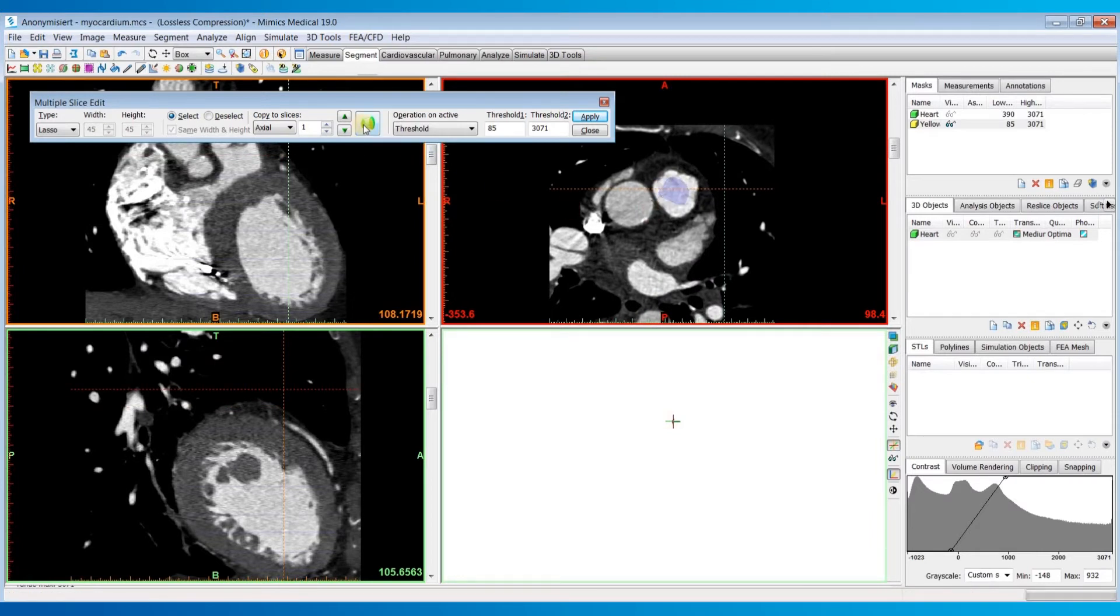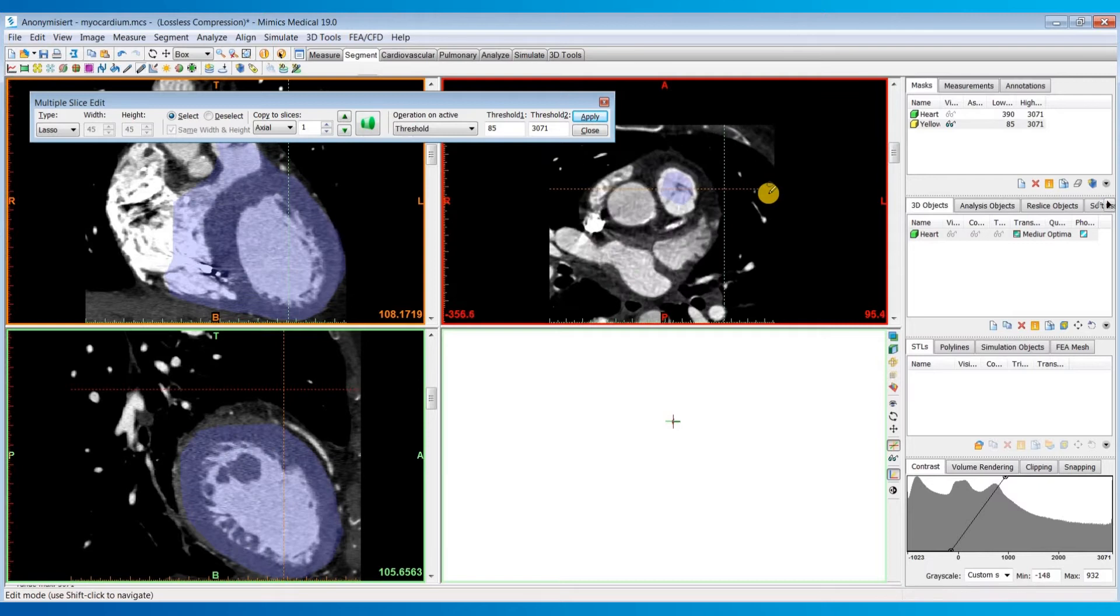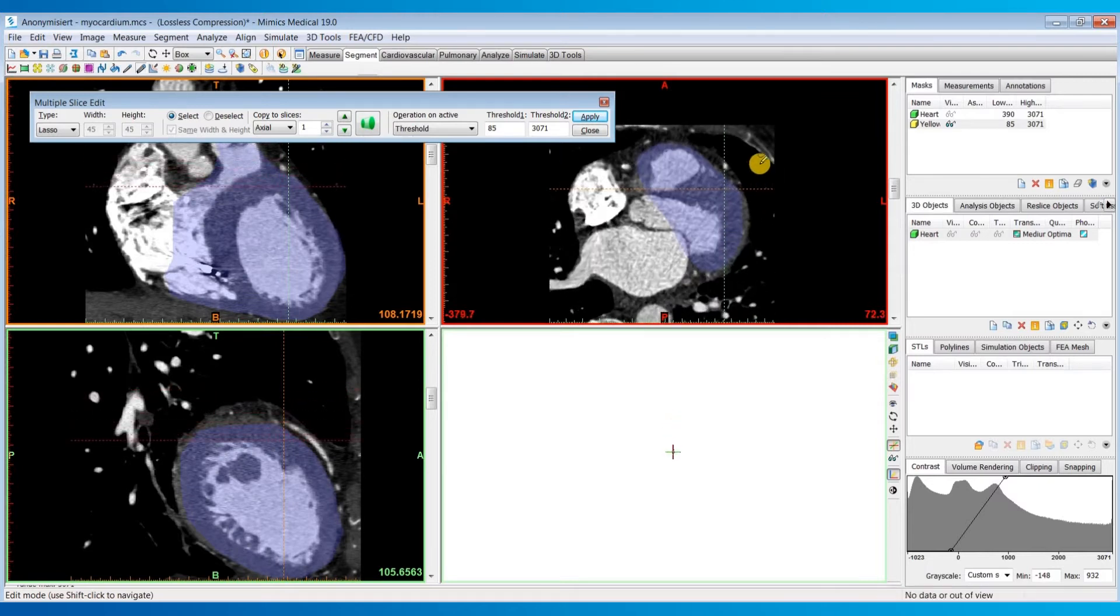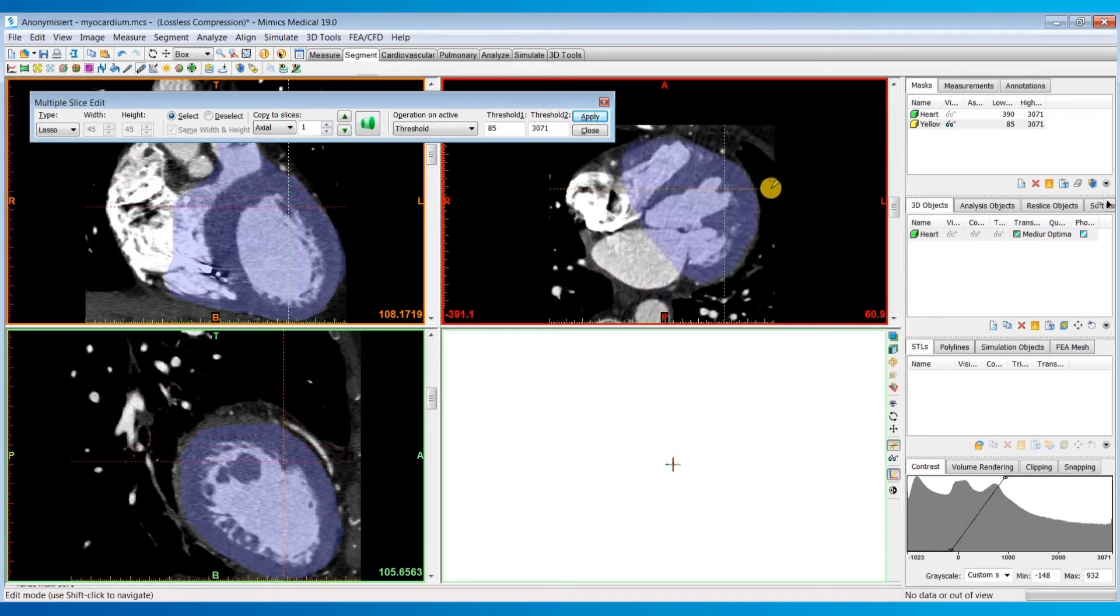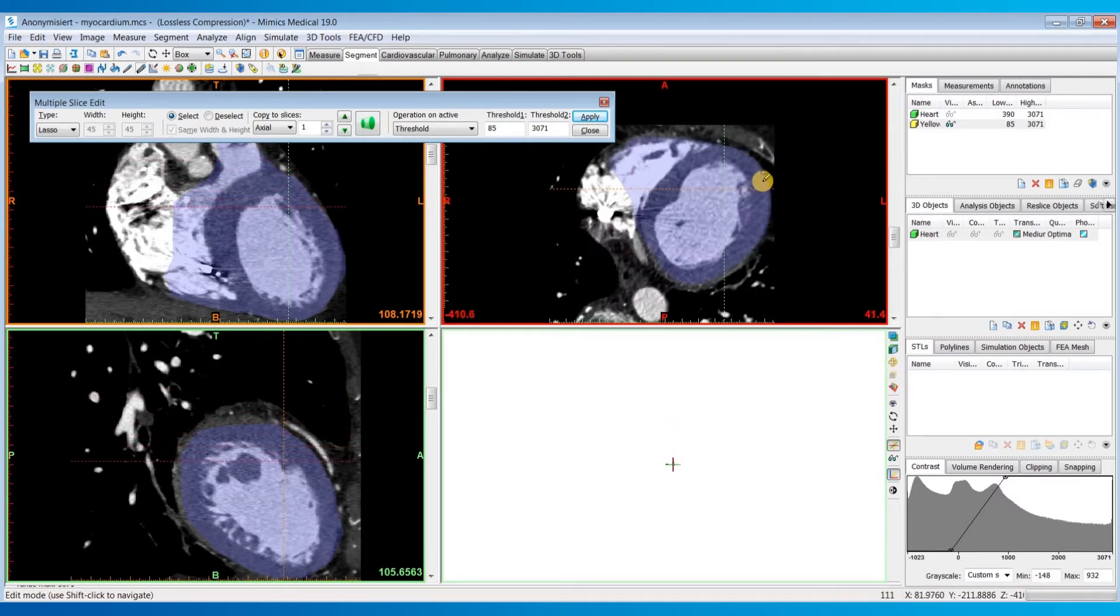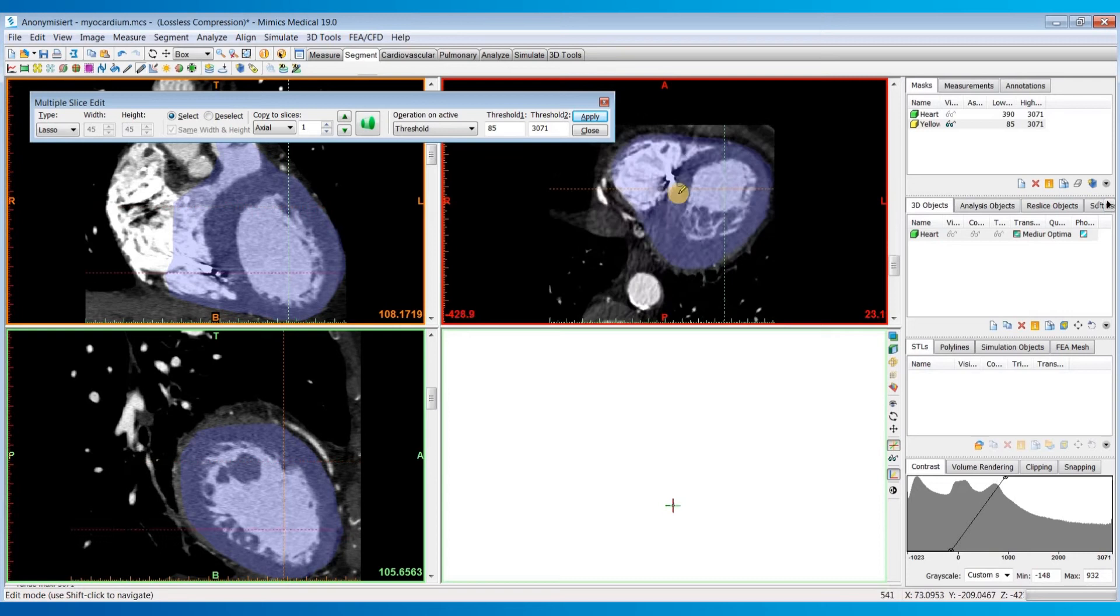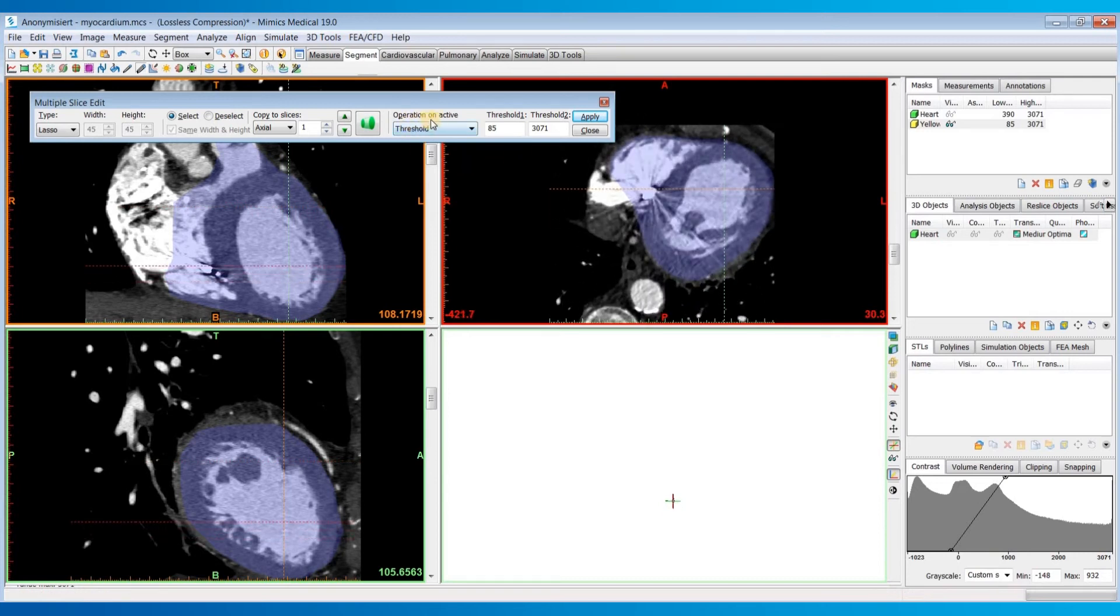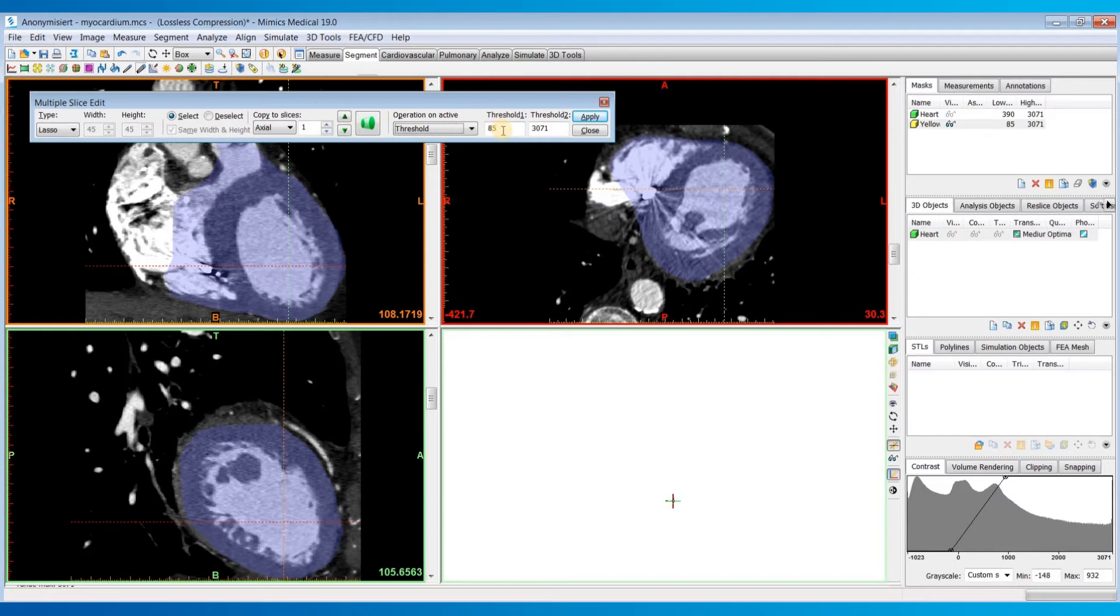After I'm done with my markings, I'll hit this green interpolate button, and then I'll scroll through the images to check out the interpolation in my selected region. I'll make sure my operation is set to threshold and that my values will be the values that we previously assigned when creating this mask, and then hit apply.